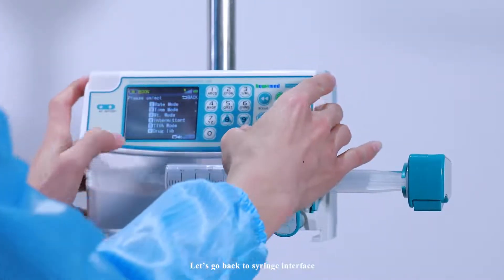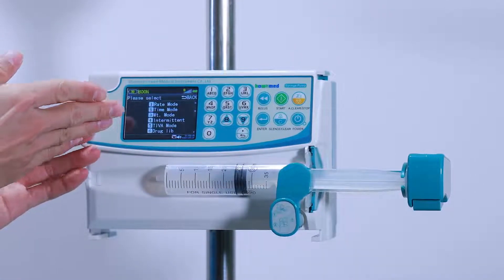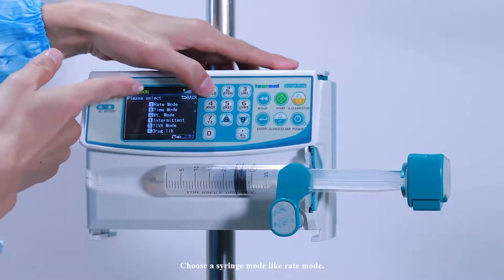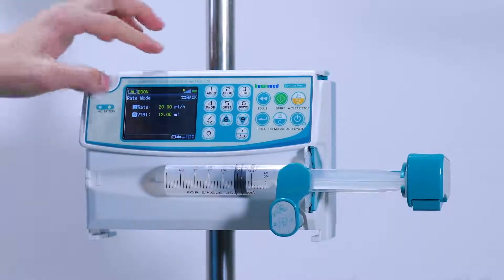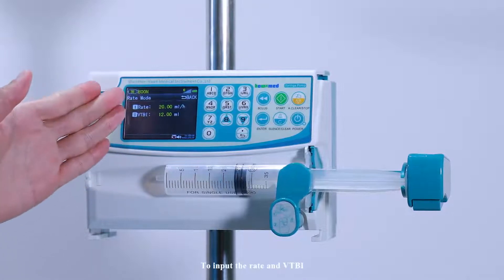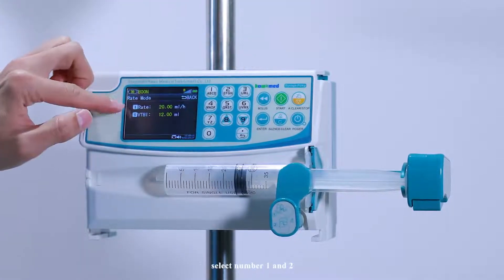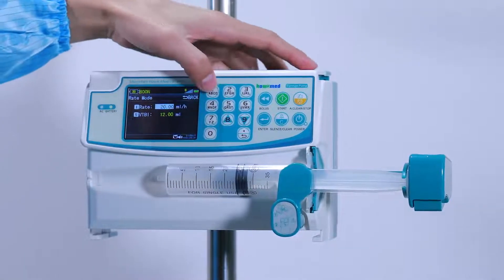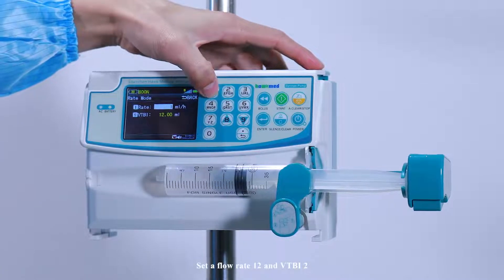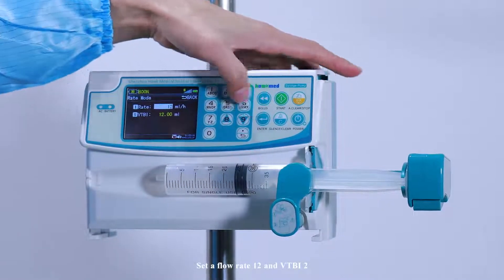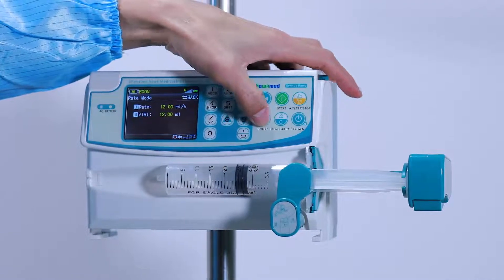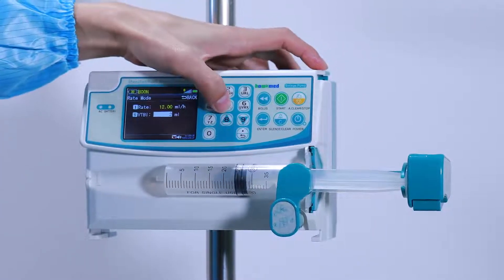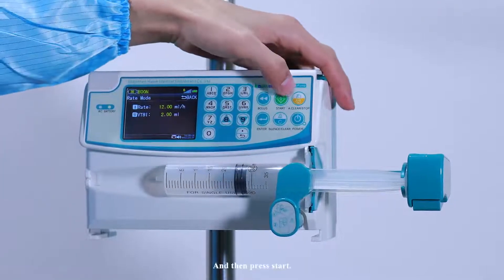Let's go back to syringe interface. Choose syringe mode like rate mode. To input rate and VTBI, select number 1 and 2. Set flow rate 12 and VTBI 2, and then press start.